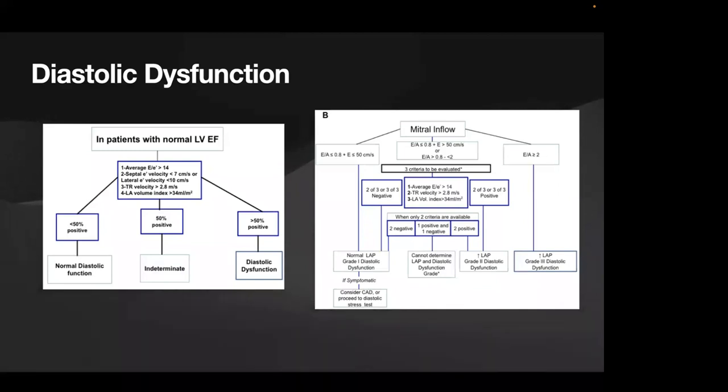So again, the Valsalva maneuver is going to change your preload, in both your right side and your left side, and that's really what you're doing. You're isolating the pressure changes at an instantaneous time with your Valsalva, and you're making a kind of de novo view of your mitral inflow. Post Valsalva, you're looking at your E and A wave patterns and how they change with your loading conditions, which is helpful to tease out some of those pseudo-normals from the normals.